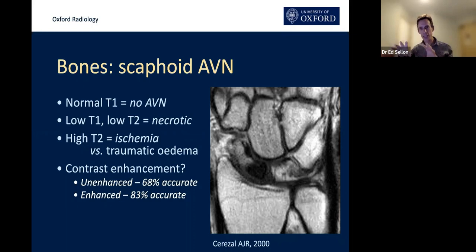What's important is whether the signal loss is diffusely low or just patchy. If it's patchy, the pattern of patchiness matters: is it proximal radial, proximal ulnar, or diffuse? And how dark — how sclerotic — is it? In this example, if the signal is really, really low and sclerotic and diffuse like this, then this is avascular necrosis — pre-collapsed AVN 100% of the time.